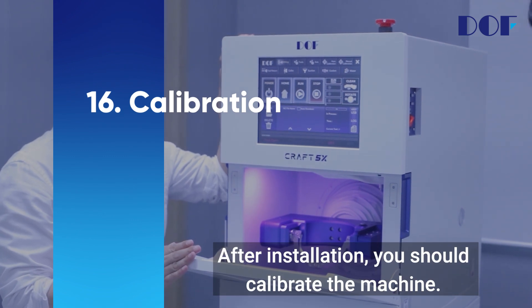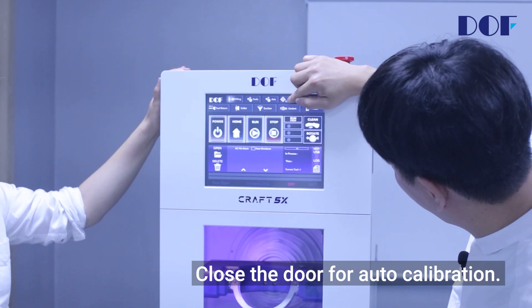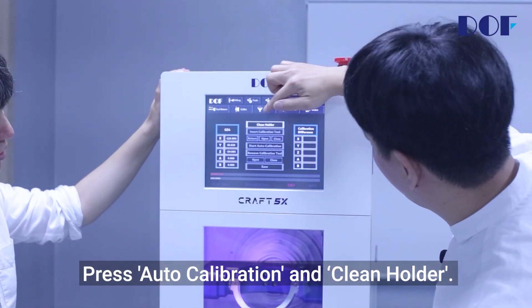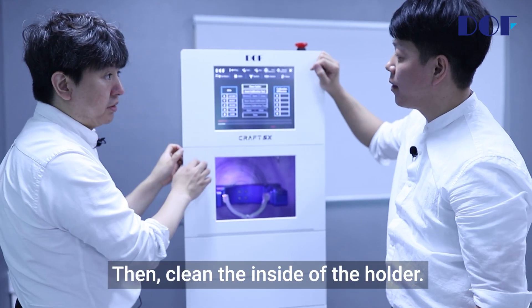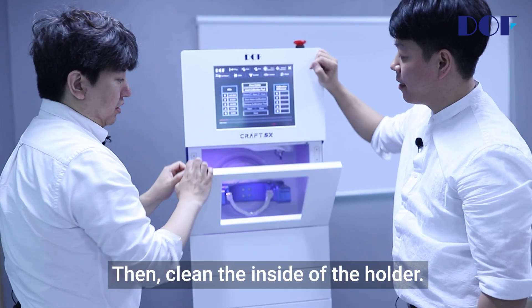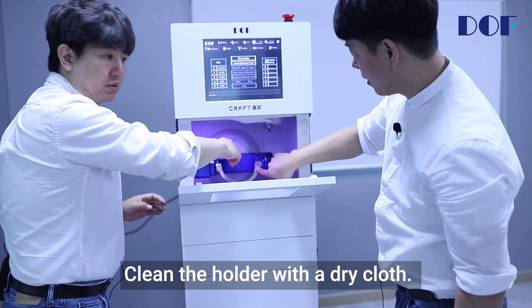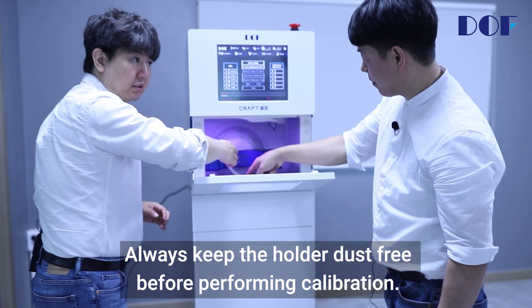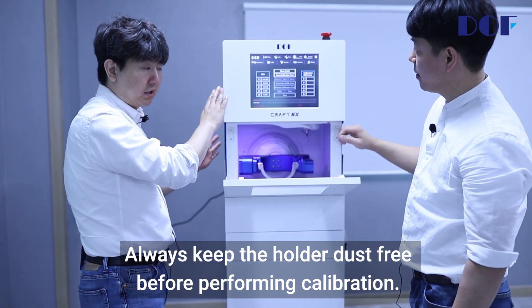After installation, you should calibrate the machine. Close the door for auto calibration. Press auto calibration and clean holder, then clean the inside of the holder. Clean the holder with a dry cloth. Always keep the holder dust free before performing calibration.